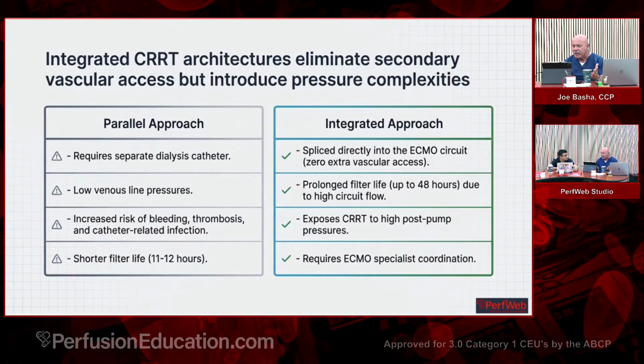Anyway, it's very easy to add these to the circuit. Now, there is something to take into consideration. Anytime you plug anything into your circuit, you are now risking, and actually that's something that we should talk about more probably in our ECMO courses. You have two sides of an ECMO. You have a negative side and you have a positive side.